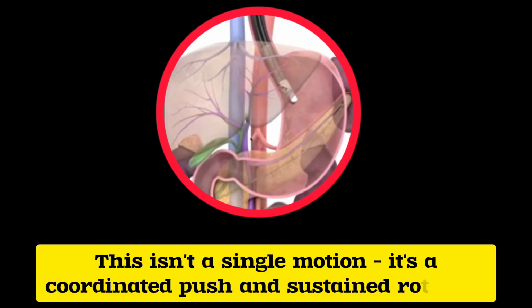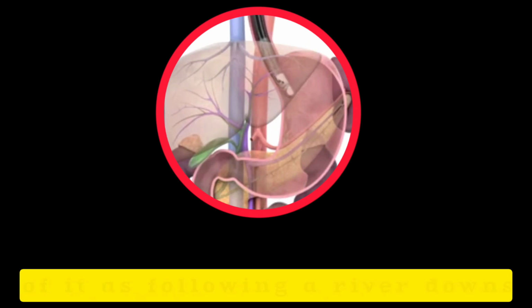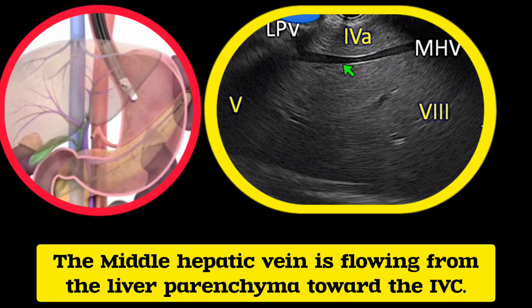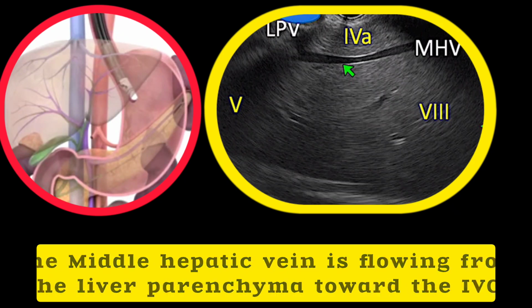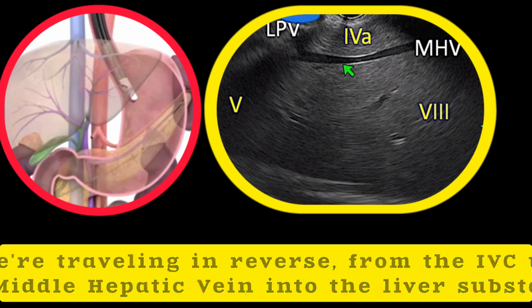This isn't a single motion. It's a coordinated push and sustained rotation. Think of it as following a river downstream. The middle hepatic vein is flowing from the liver parenchyma toward the IVC. We're traveling in reverse, from the IVC up the middle hepatic vein into the liver substance.